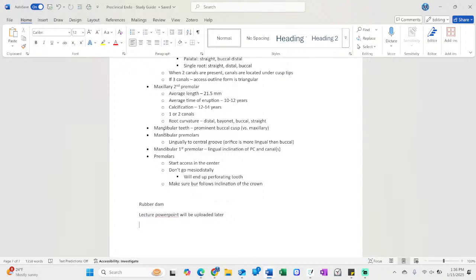It's similar to this whole single unit, but the benefit of using a single unit is that you're not getting saliva all over the place. What I found with doing the clamp and the rubber dam together is that saliva gets all over the place, and then you're trying to hold the rubber dam back, and your assistant's trying to help you. Things are falling all over the hole that you're trying to look through to make sure that you're putting it on the right tooth.